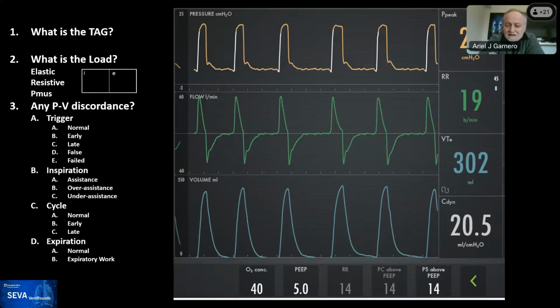So thank you very much. This just highlights, number one, the paper, but number two, the fact that our knowledge base regarding how these algorithms work is scant, and so we have to continue to work on seeing how these modes work so that we can apply them better and know what to expect for our patients. So wonderful work from all of you.